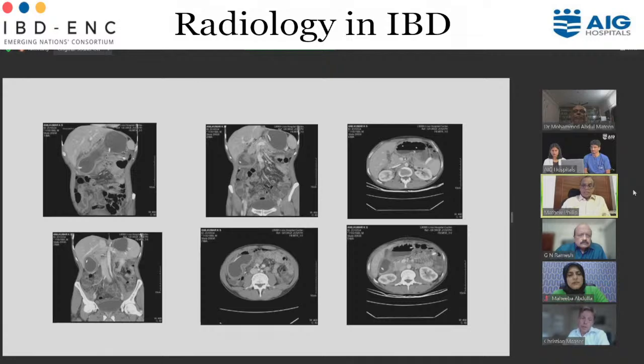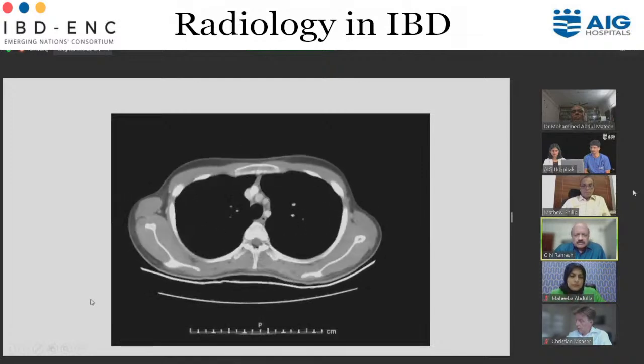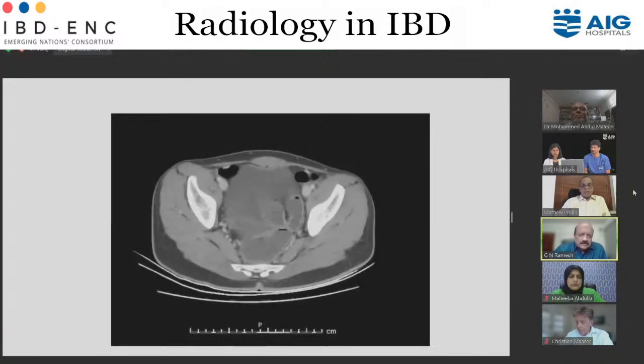Next, any other comments, Ramesh, on this? Next. I just wanted to get Dr. Mateen's opinion. Looking at these images, is it possible for us to say that there is a lot of inflammation there, because I don't find much of enhancement in that region.